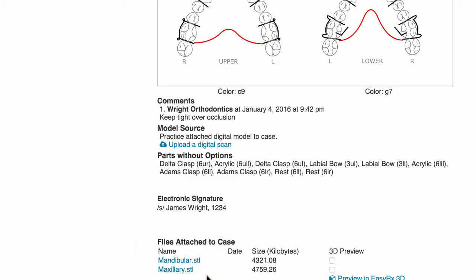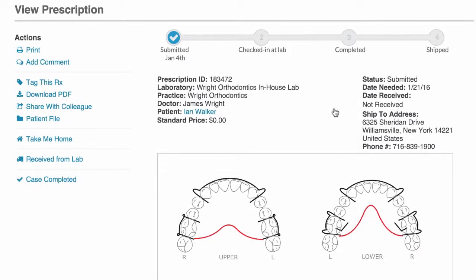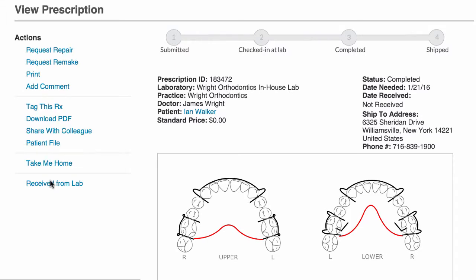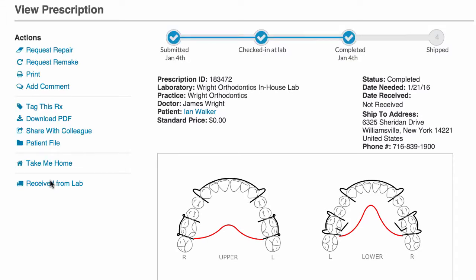When the production of the case has been completed, on the view page click completed from the actions menu. That tracks the completed date, and will now give you the ability to mark the case as received when it's reached the clinical area, tracking when it was received at the practice and at which location.